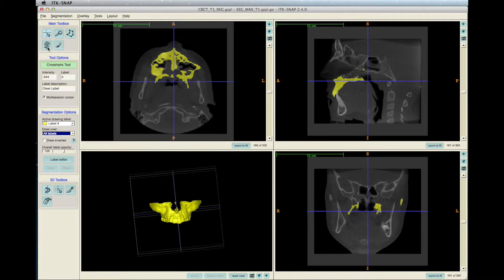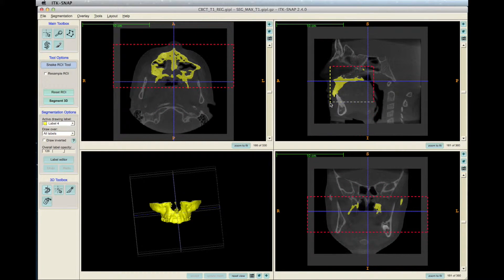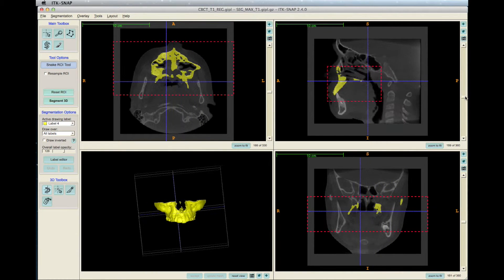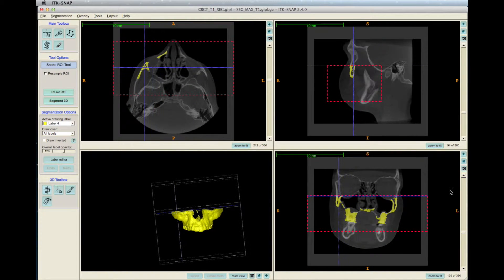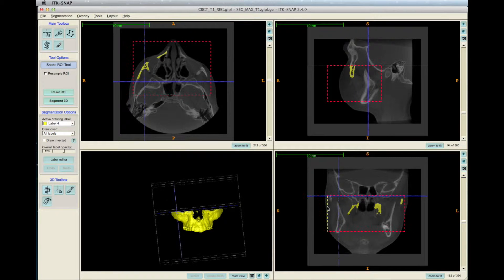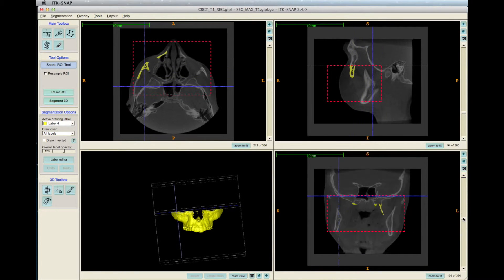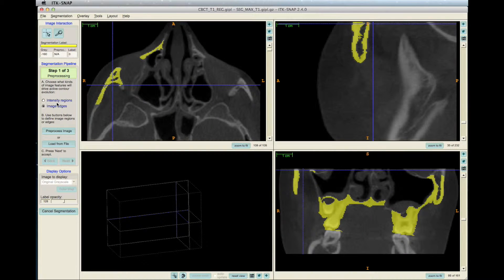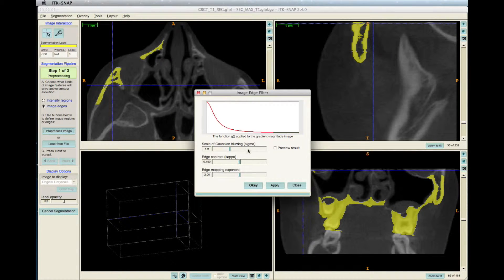Click the snake icon and alter the red lines to select the maxilla. Click Segment 3D on the left toolbar and select the image edges. Slide the three bars as needed, then click OK.